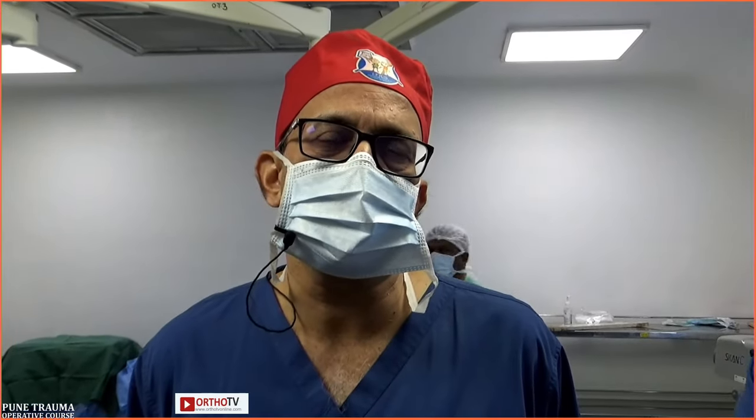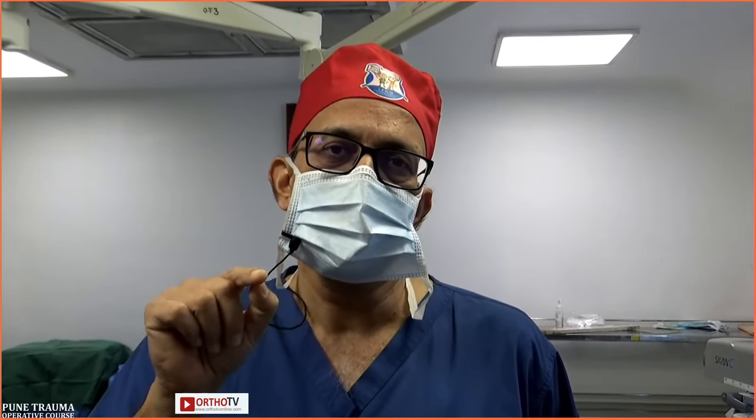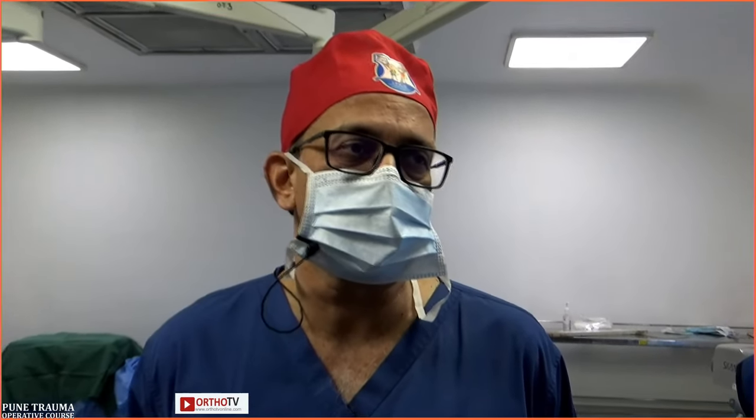And for massive swelling, I think everybody should develop something called finger memory. Once you, Taral, as he said, walk the bone with your K-wire, you have to develop a feel, even if there is swelling, that you are on bone, and then go across, and feel the second cortex with the K-wire. The K-wire tip should have sensations. It should become an extension of your finger. Yes, absolutely. And again, unless you do it, you will not develop it. So it's a learning curve.